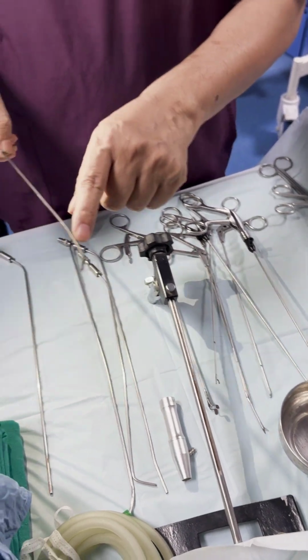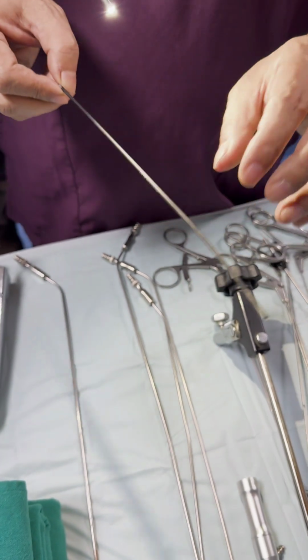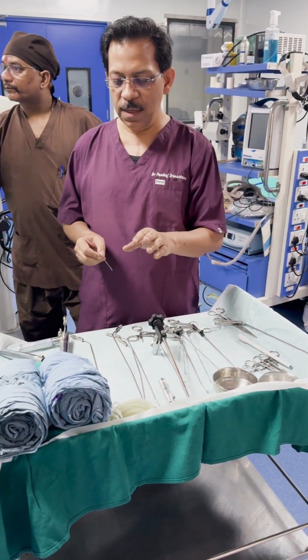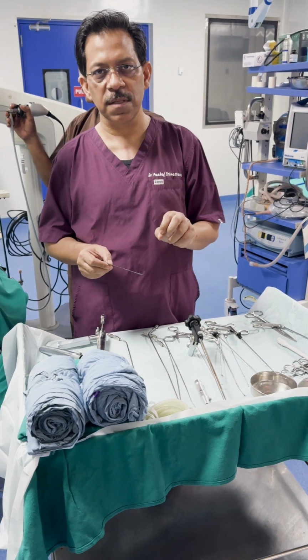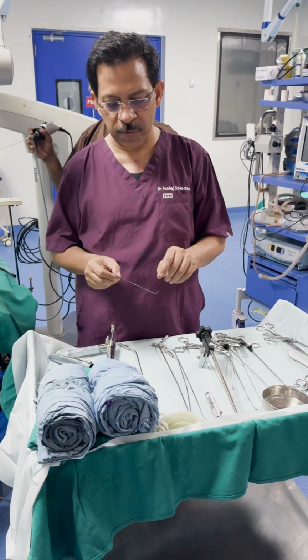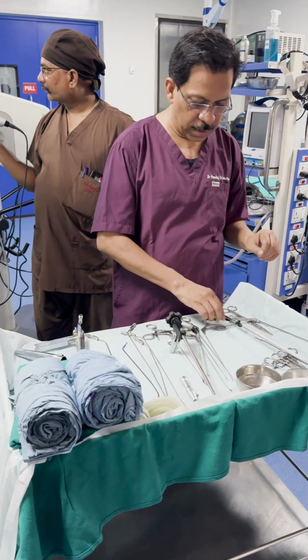Then we have a tilted radio frequency tip for taking biopsy and operating instruments. That is important. So in lesions like polyp or hemangioma or things like that, when we do it by cold instruments, that is not enough, because if the base is there, we will have a recurrence. So we will have to cauterize this either by laser or by radio frequency, so that the voice quality is not disturbed and the lesion is not recurrent.